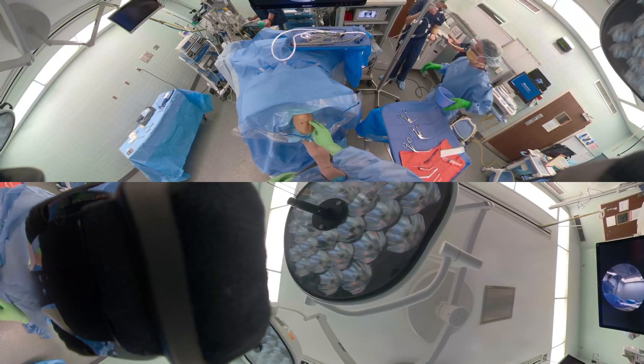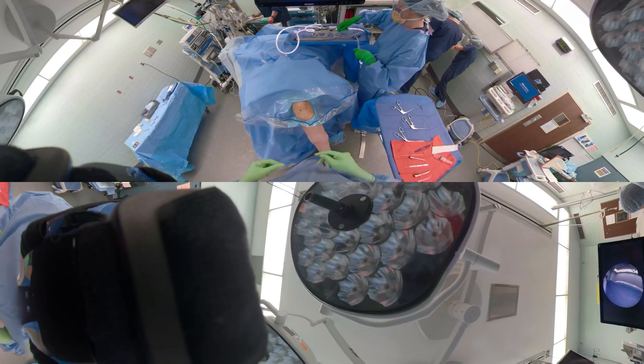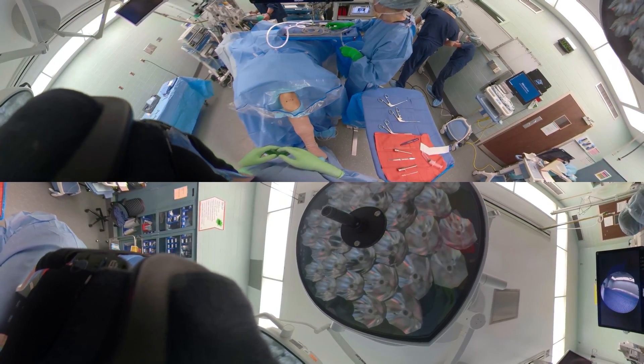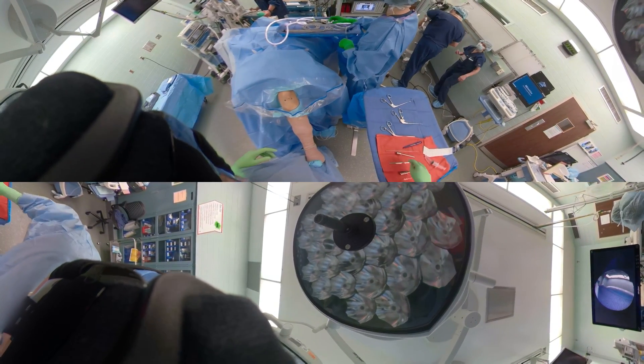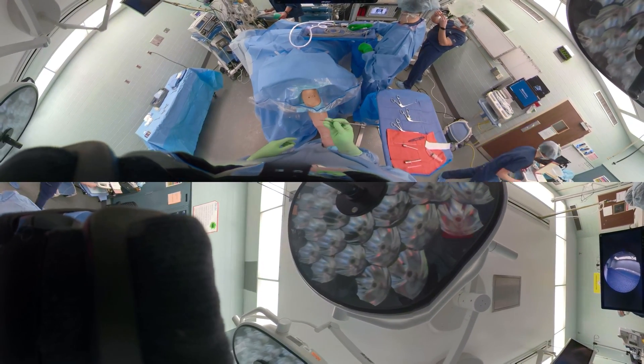Personally I do horizontal portals, though you can also do vertical portals. Go ahead and make the skin incision through the capsule into the fat pad, and make it big enough so there'll be ease of movement of the cannula and the scope.